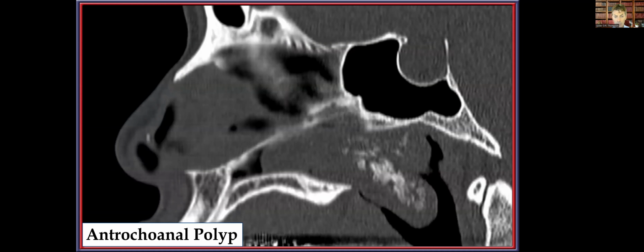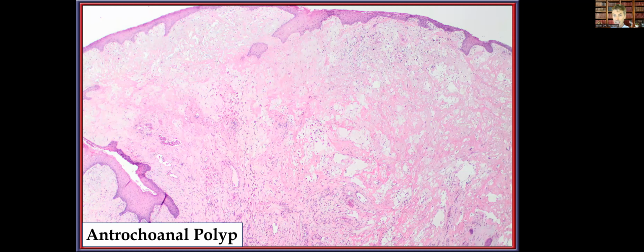I must mention an antrochoanal polyp just for a moment. This is a tumor that arises within the maxillary sinus, pushes out through the choana, and then presents in a similar fashion, where you can see this very large polypoid lesion that can be a mimic on radiographic imaging for an angiofibroma. But when you look at the tissue, you will notice that there is no evidence of any sort of glandular or minor mucous glands, but instead you do have a spindled population with this edematous type background stroma that is often destroyed or undergoes degeneration.